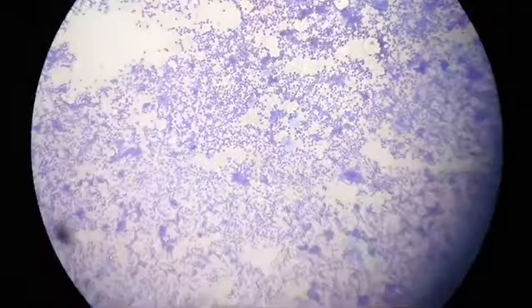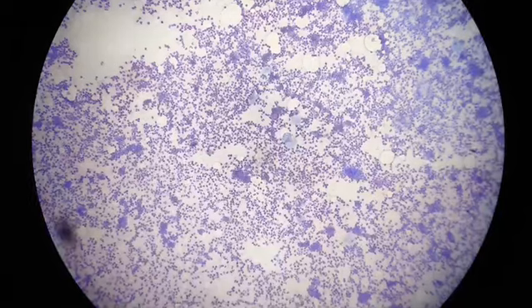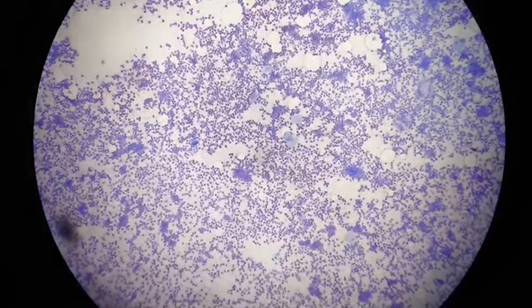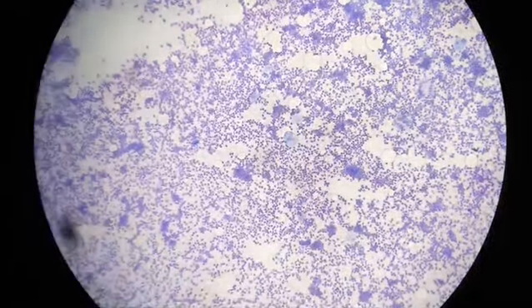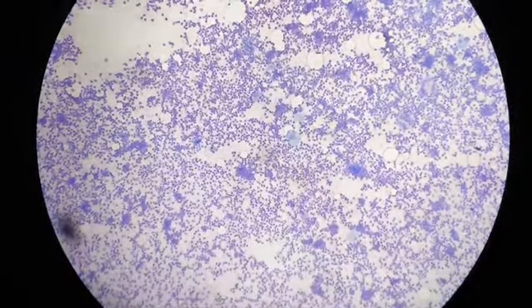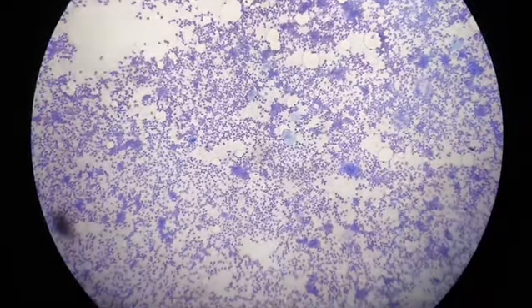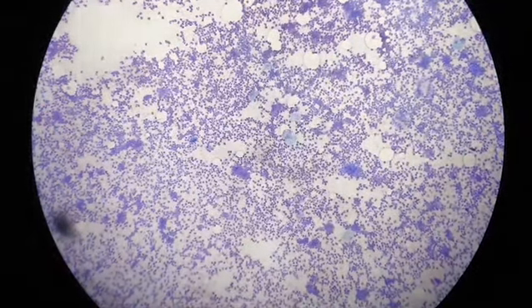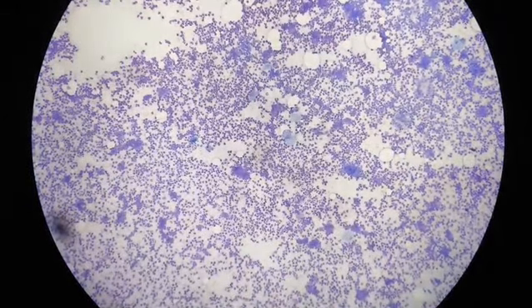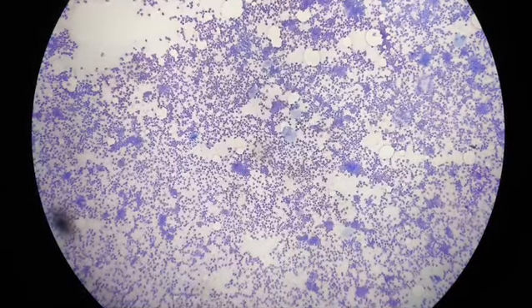So, today we'll be discussing a case of subareolar breast abscess in a 45-year-old female. We got a FNAC requisition for a 45-year-old female with left retroareolar, or you can say subareolar, swelling. It was just beneath the nipple areolar complex in the left breast, and the swelling was markedly painful.